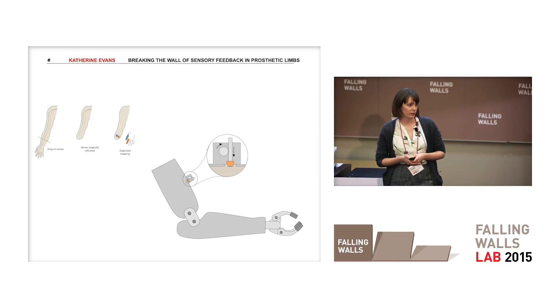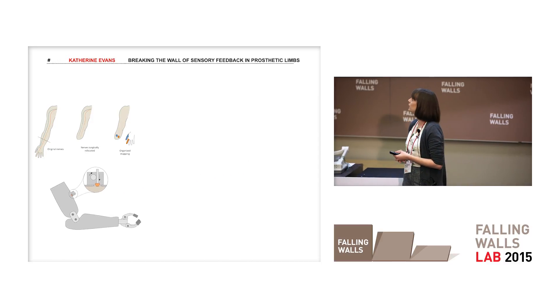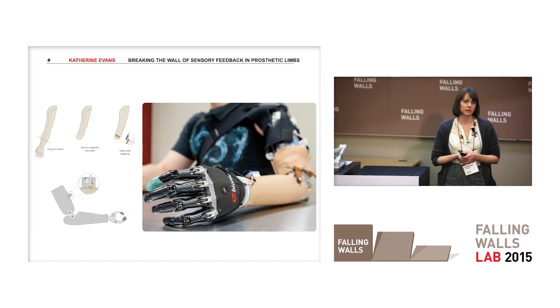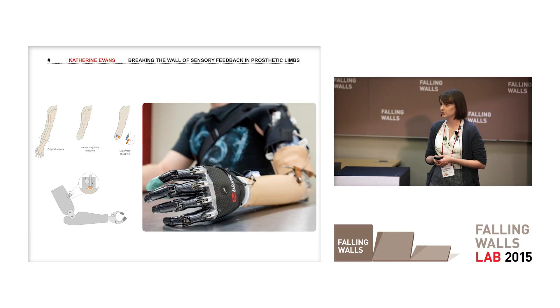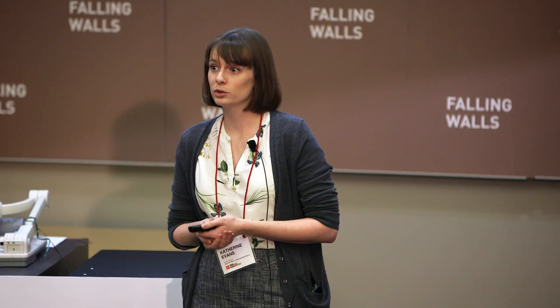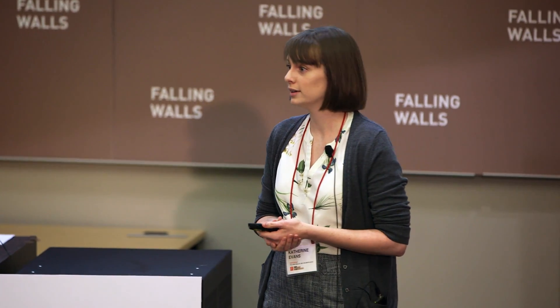Here you can see my prototype system that I've integrated onto a prosthetic arm. We were very fortunate to have an amputee volunteer come into our lab and test out the system, and at the end of the day we asked him: would you want this integrated onto your daily prosthesis? His response was five out of five — yes, I would. This was very exciting for us.